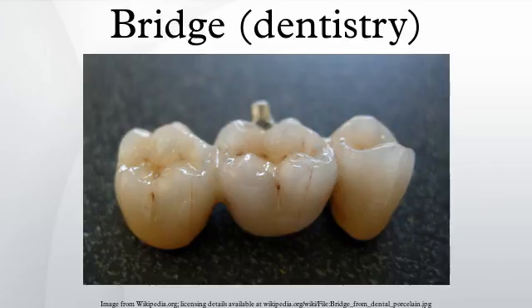This is accomplished with a solder index. The proximal surfaces of the sectioned units are roughened and the relationship is preserved with a material that will hold on to both sides, such as GC pattern resin. With the two bridge abutments individually seated on their prepared abutment teeth, the resin is applied to the location of the sectioning to re-establish a proper spatial relationship between the two pieces. This can then be sent to the lab where the two pieces will be soldered and returned for another try-on or final cementation. See also: dental restoration, fixed prosthodontics, resin-retained bridge.